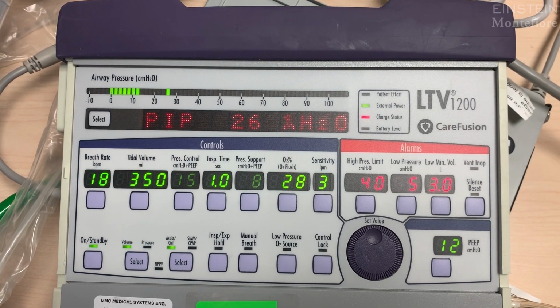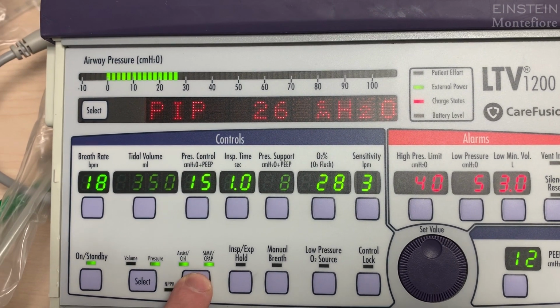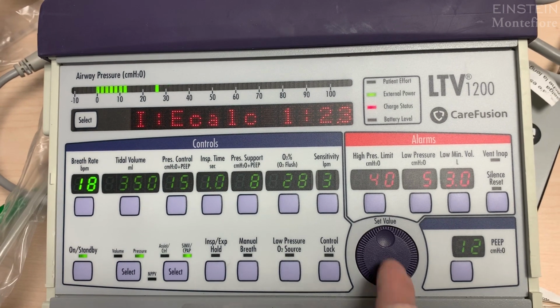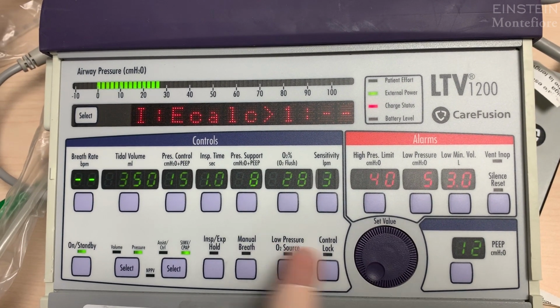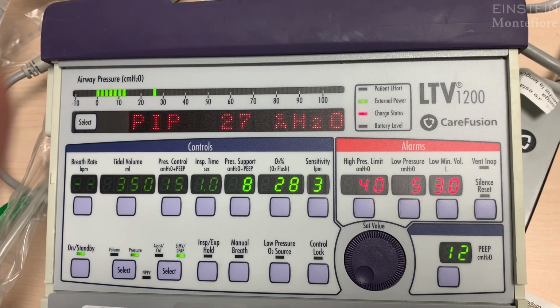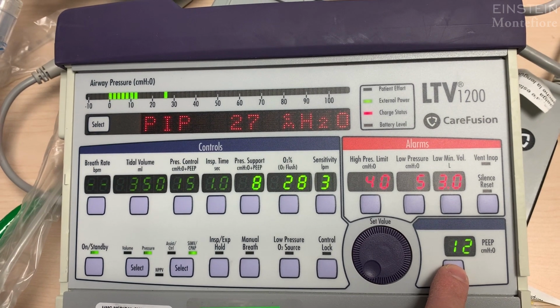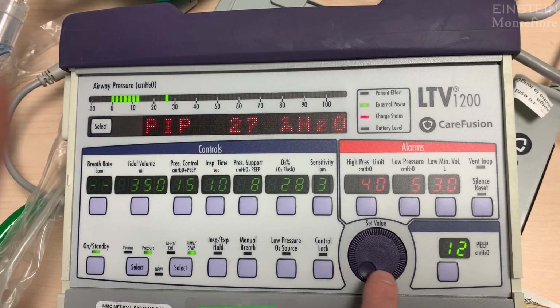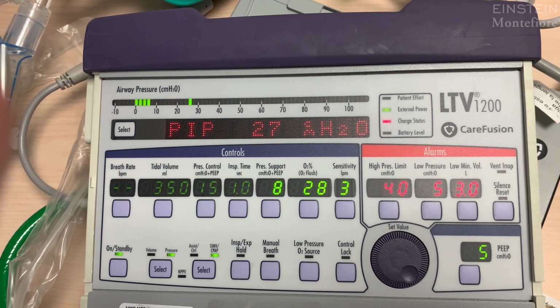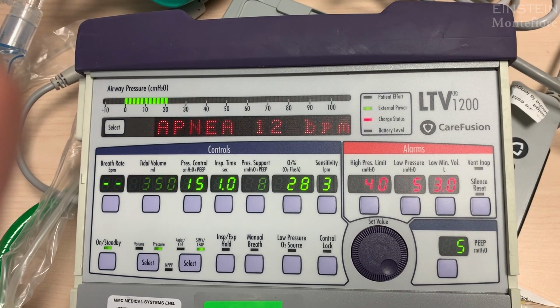To put a patient on pressure support on the LTV ventilator, you need to change to pressure mode, change to CPAP. You hit each button twice, and then you put the patient down to a breath rate of 0. So now they're just getting pressure support at 8 with a PEEP above 12. So then, of course, if we want to put them on pressure support 8, a PEEP of 5, you'd have to turn this down to 5 as well. And there is a backup rate, so the ventilator should alarm eventually.